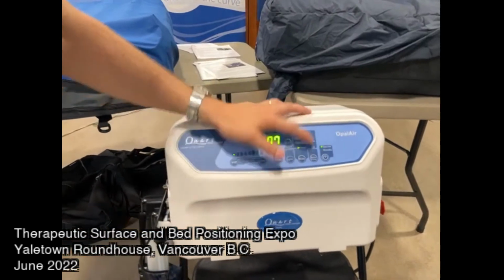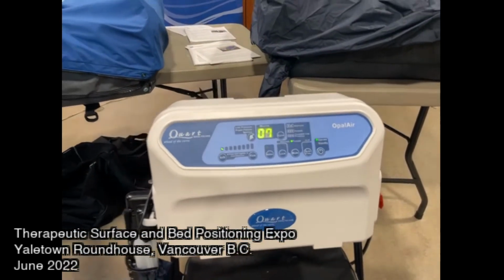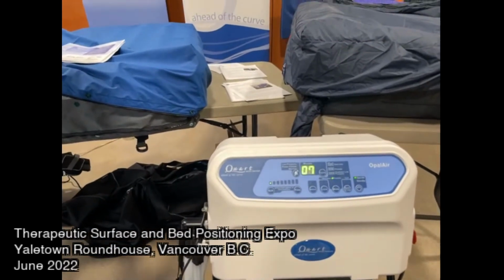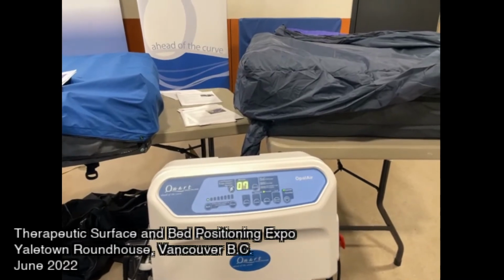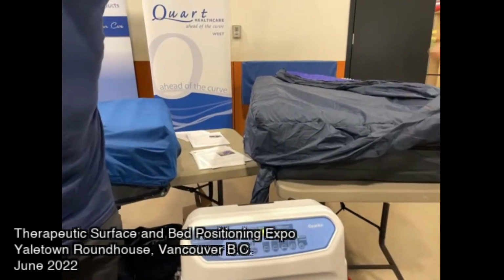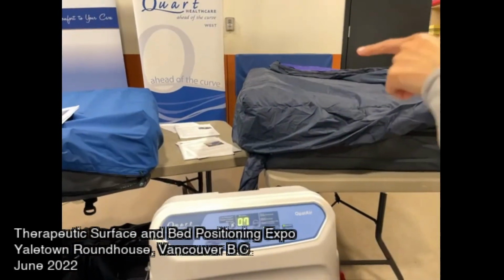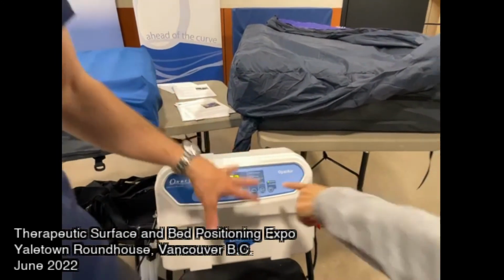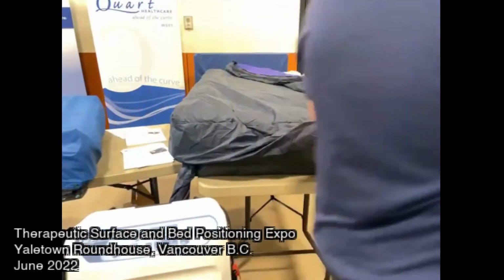And then CLP, that's designed for residents that can't stand the pressure changes, or they're in palliative care, or they're hypersensitive. So it just brings you to a static surface. Is the whole mattress like that? Does it have any borders? Oh, in terms of which ones? Any of them.